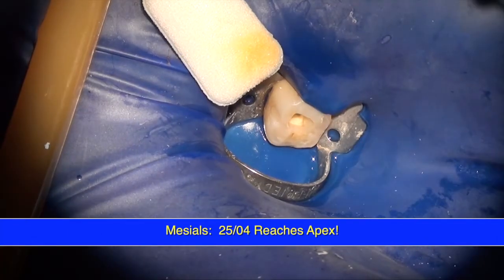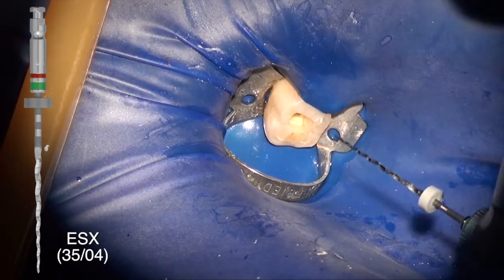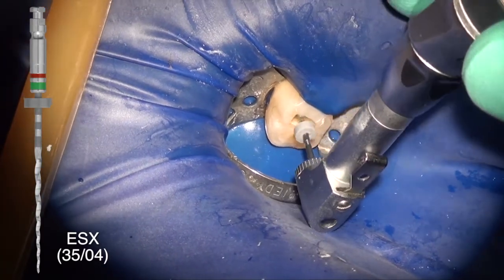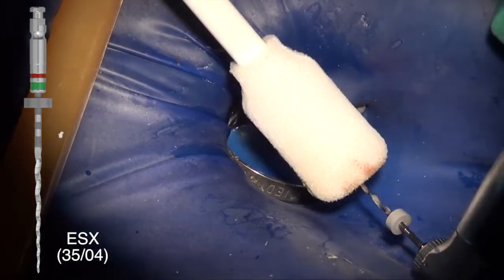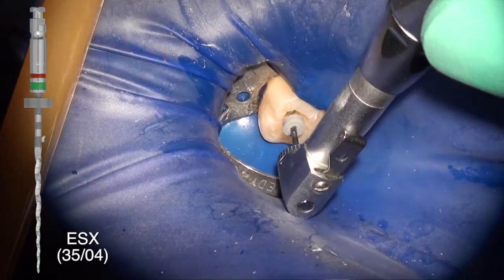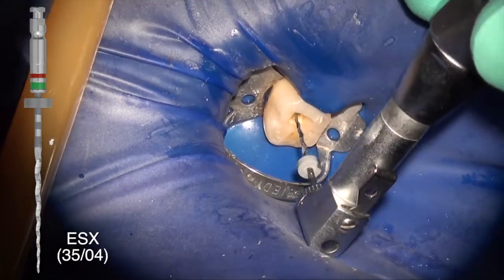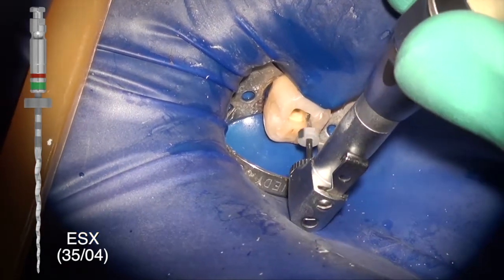I decided at this point I could have used the ultrasonic to remove any remaining tissue, but I wanted to go to a larger size, so I just decided to go to a 35 on the mesials as well. So again, as you can see, I'm doing the same SSC. I'm going only to engagement. My goal is not to push the file down to resistance or to the apex, but rather just use the weight of the handpiece and let the file do a little bit of cutting and then quickly remove it and have my assistant wipe it with this Revoled Endo Swipe, which will be available soon, by the way.